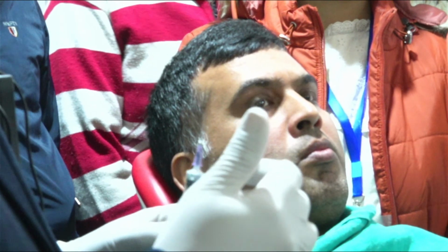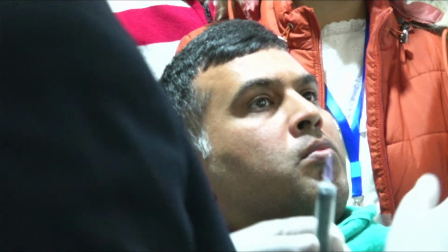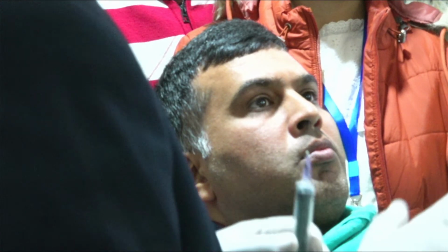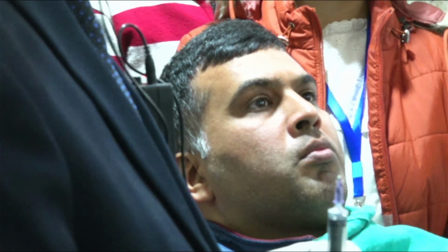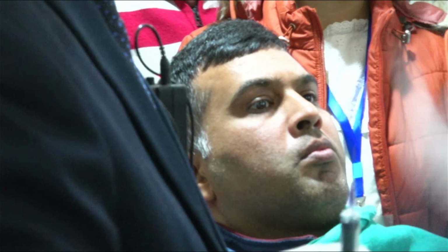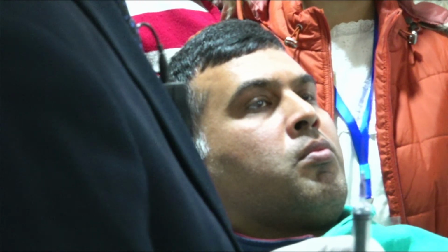Keep on playing. The LANAP procedure, laser assisted new attachment procedure, has to be used only with the 1064 nanometer wavelength in the Nd:YAG laser, because one of the researchers published on 810 and 940 and said it is not a pure LANAP, as it has to be done with 1064 Nd:YAG.